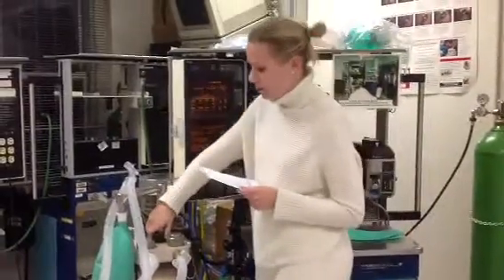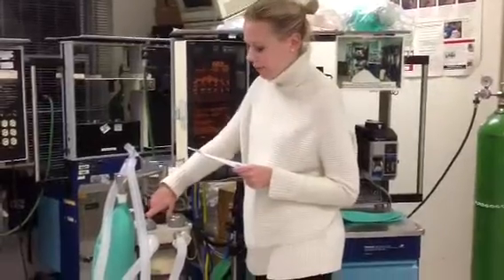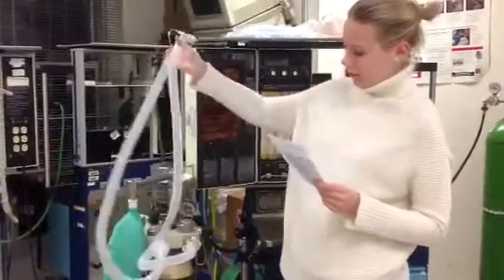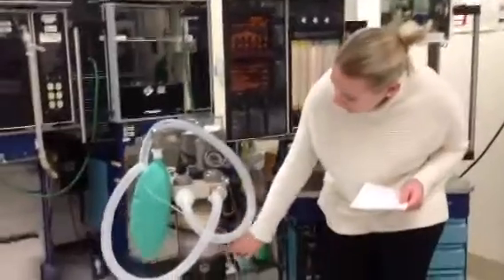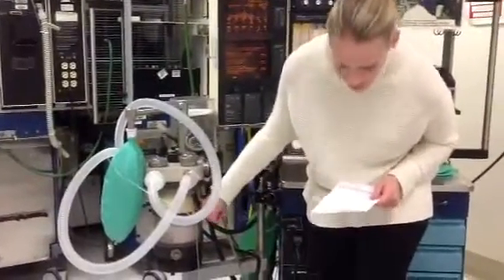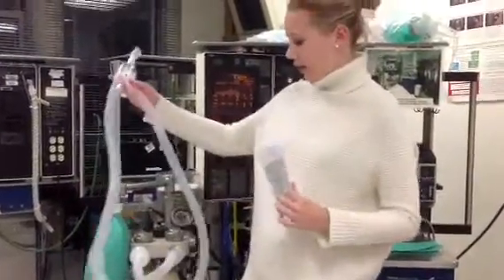So then put your valve on the bag mode, check that the breathing circuit is intact, there's no damage or disconnections, verify that the CO2 absorbent is not desiccated or dry, and then attach any PEEP or humidifier you need to use down here.